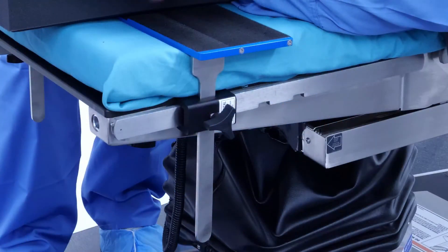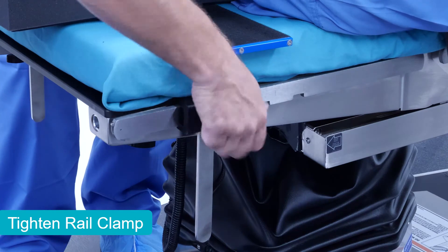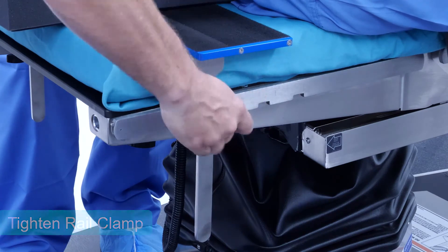Once the patient is in position, ensure that both rail clamps are tight and secure against the side rail of the surgical table.